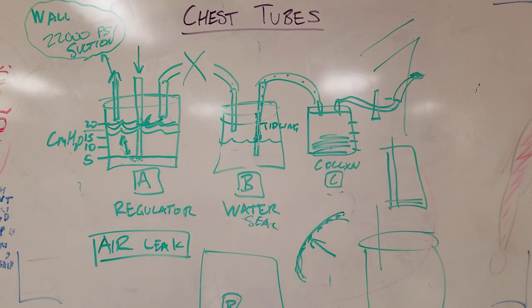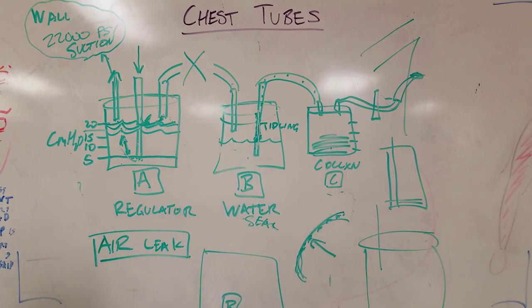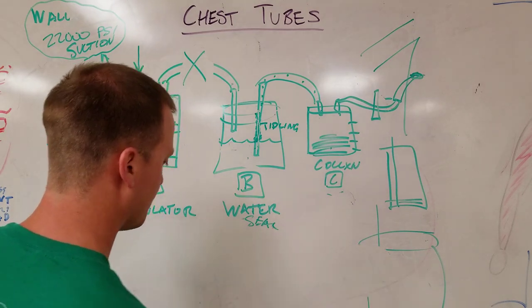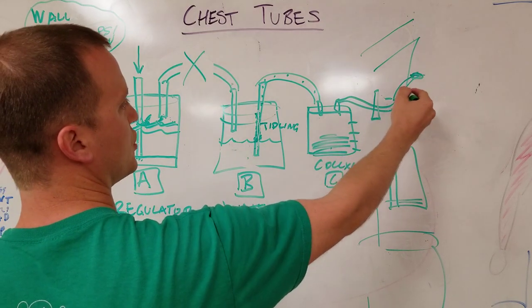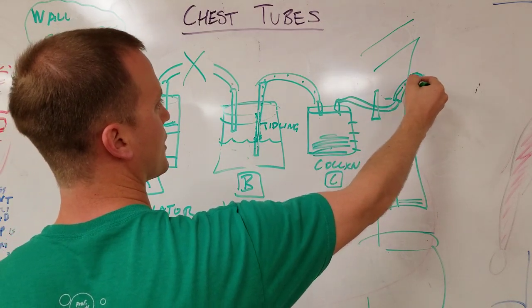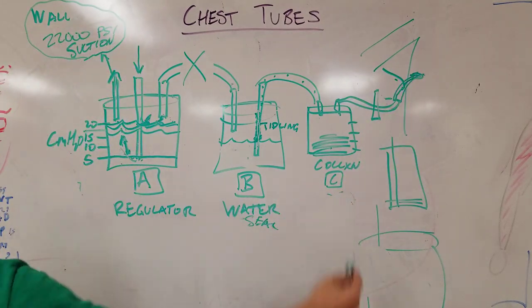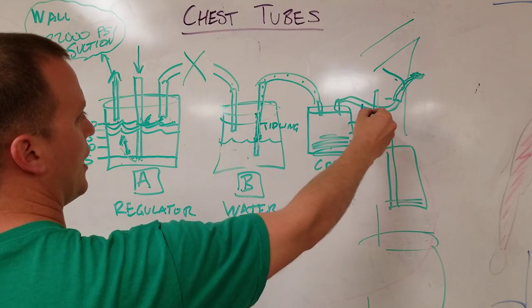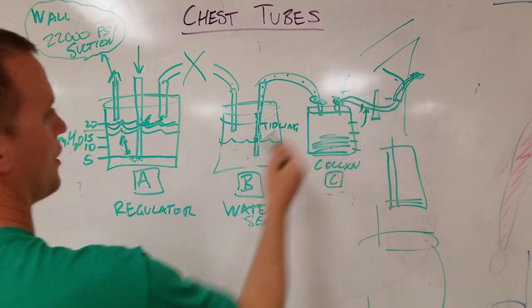Now, what happens if you do have an air leak? Well, that means that somewhere between here and the patient's lung, there's some sort of extraneous air getting in to the circuit. Where can that come from? Well, that can come from a poorly placed chest tube. Let's say that your chest tube, your sentinel hole that we talked about earlier and the break in the radiopaque line is outside the chest. Air could come through there. Let's say that someone cut your chest with a pair of scissors accidentally, air could come from there. Let's say that one of these hookups was loose, air could come through there.